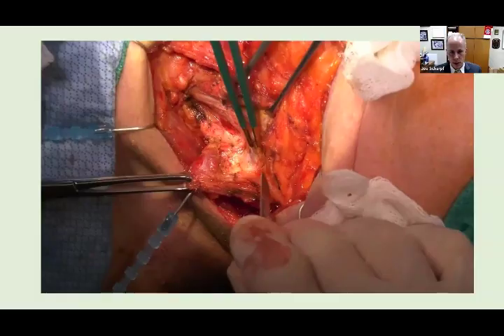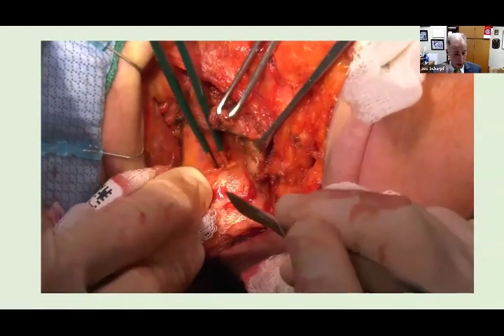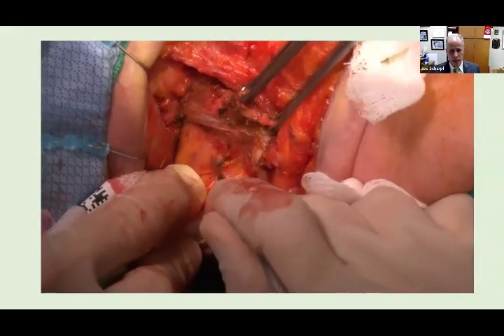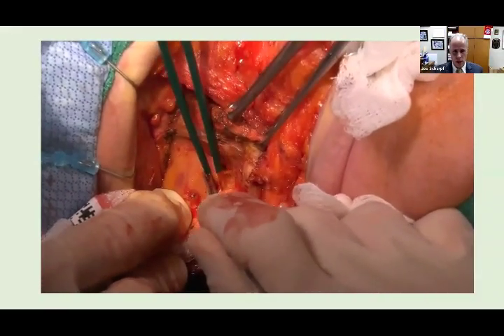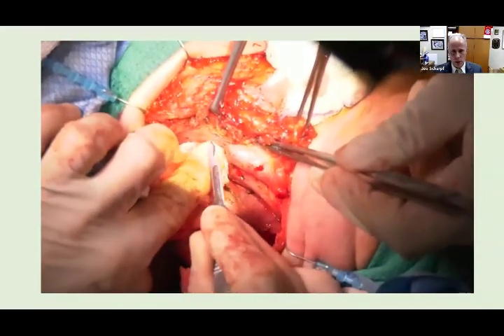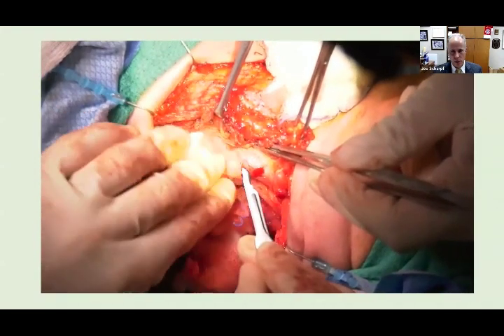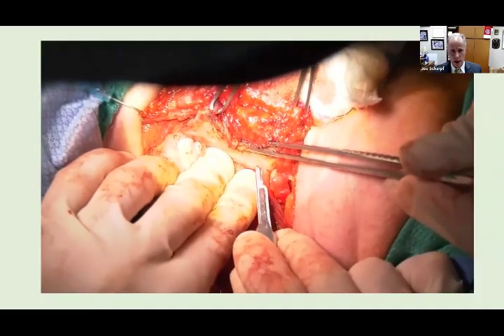Now, I do my neck dissections pretty much just with the scalpel, with a 10 blade or 15 blade. I like the 10 blade because it doesn't bury into the tissue. You can see in these anaplastic cases that there's a lot of scarring that occurs, kind of necrosis on the tissue. And I'm defining some of the great vessels, getting it off there with the blade. You really can't use hemostats much on this. I don't ever with my necks anyway. So I like to use a scalpel for all the neck dissections.